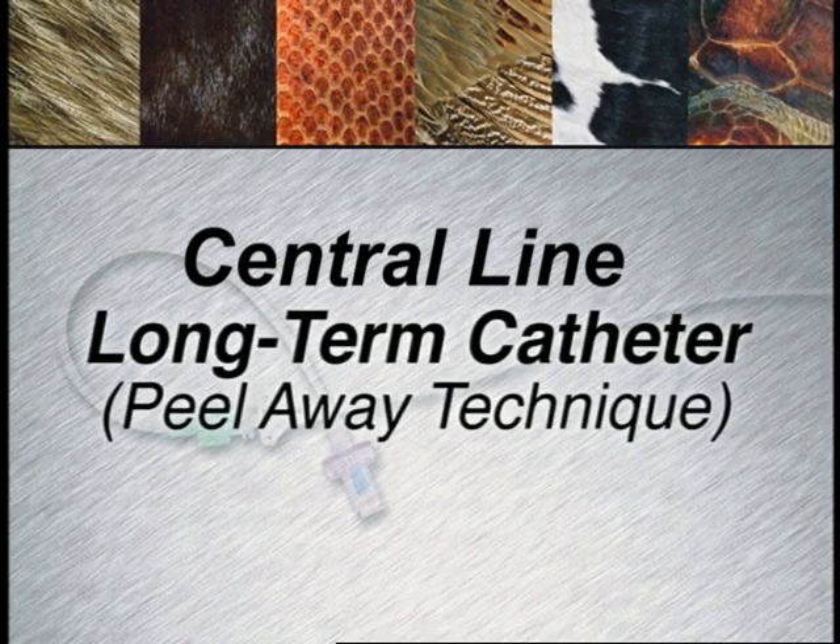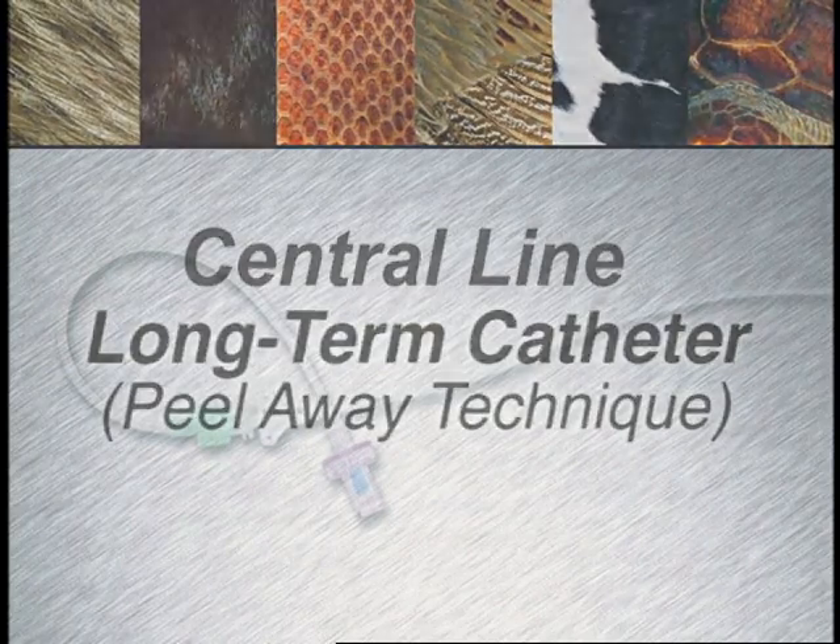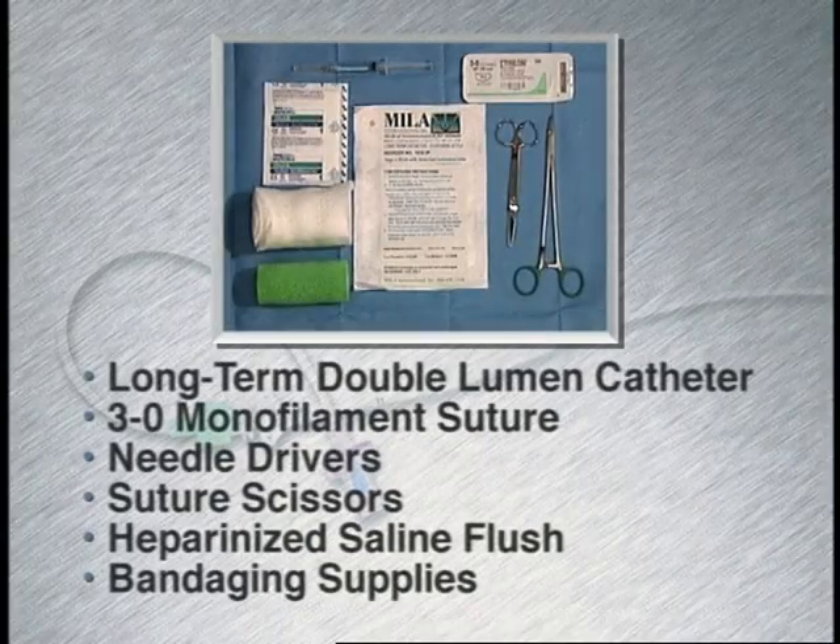This technique will discuss placement of a long-term catheter using a peel-away technique. The following supplies will be needed.